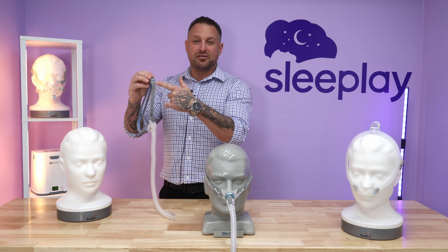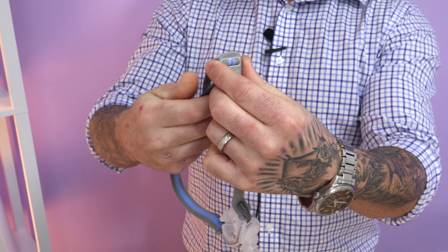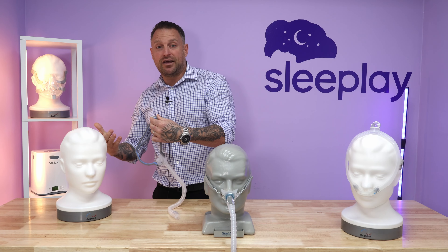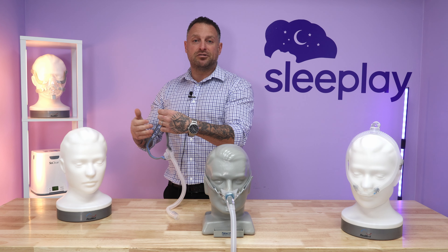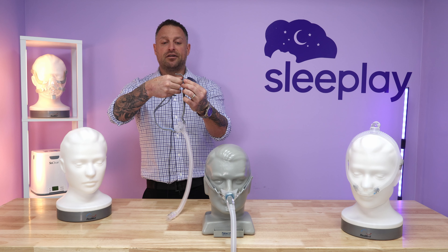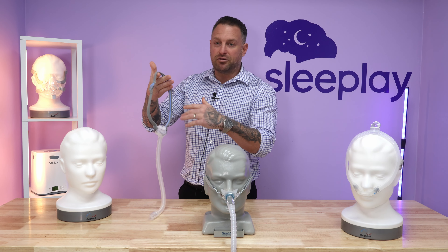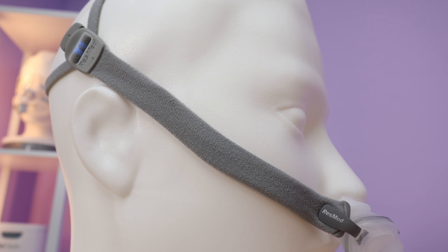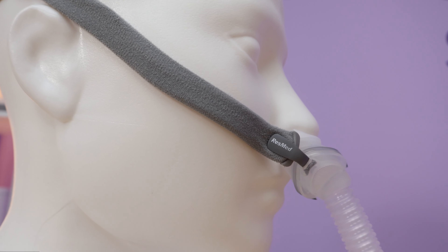What they did though is they put this little sizing tool, which is awesome. If you just hold on to that and pull this gray tab, it makes it smaller. If you find it is coming off your head in the middle of the night, you can just tighten it a little bit and it should alleviate that issue. If you hold on to the rubber tube and pull the headgear opposite, it opens it up and makes it a little larger. This mask is very small and people love it.